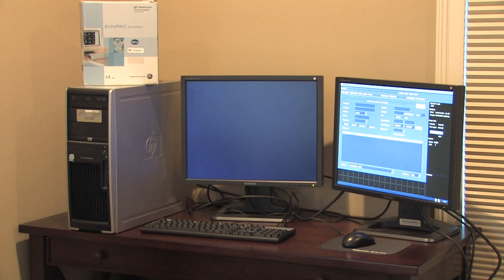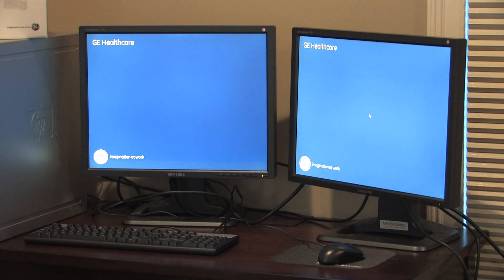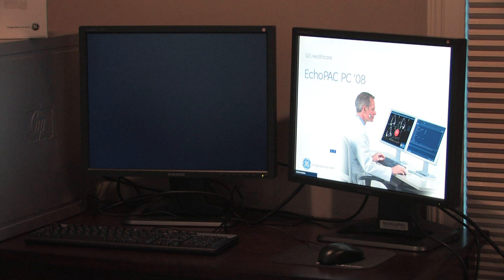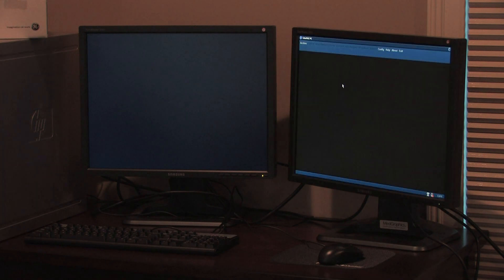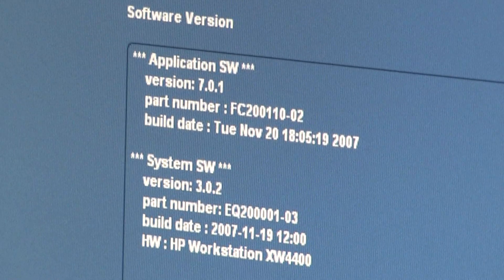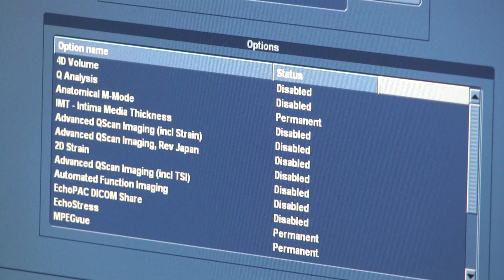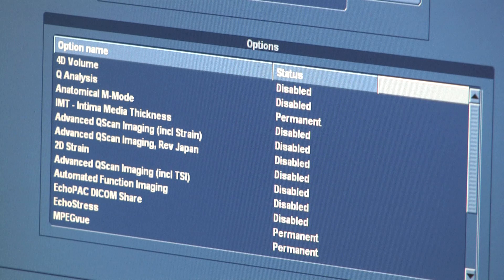This is the Echo Pack workstation booting up so you can see that it functions properly and both monitors work. I've speeded up this sequence — it does take a little bit longer than that to boot up. This is the software version for the Echo Pack workstation, and these are the installed functions.